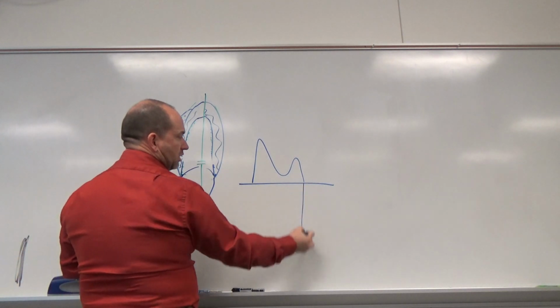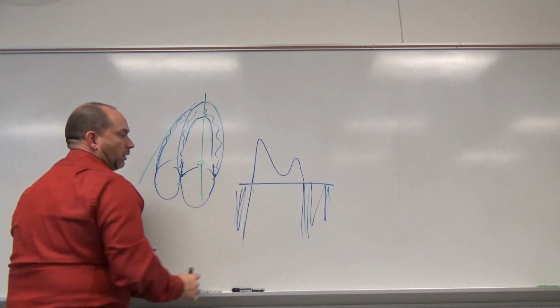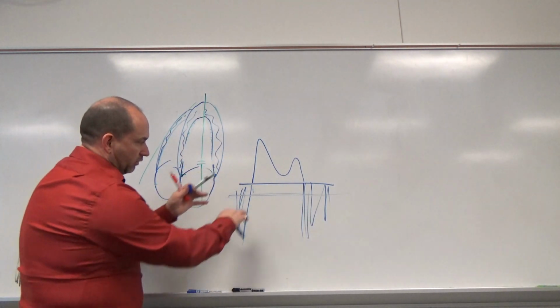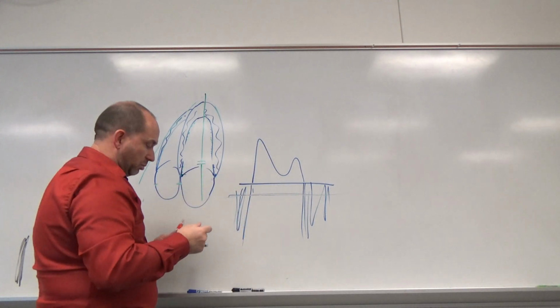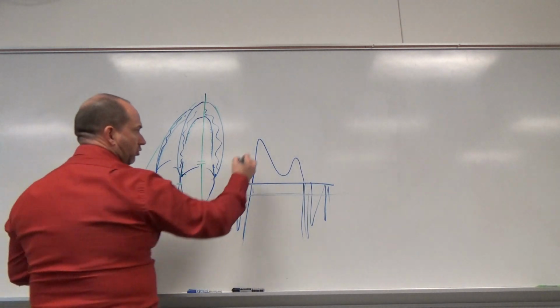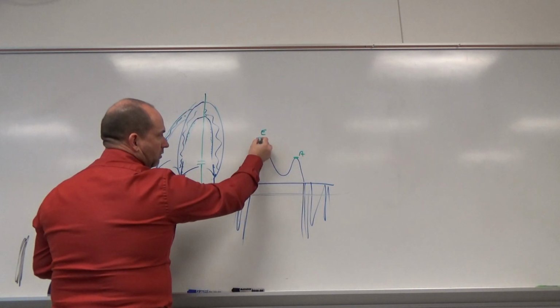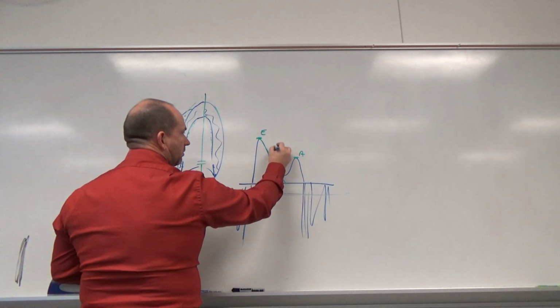If there's a regurgitation, you'll see some regurgitation go down below on either side of that waveform below baseline. But again, we're going to take our baseline to about here. Okay, we're going to bring the baseline down so the bottom of the image is here. And this should be near the top of the image display so that we can get the best possible measurement. On this, what we're going to measure is the peak E. Here's your A wave. We're going to measure the peak of the A. We're going to do the decel slope. Measures to baseline.